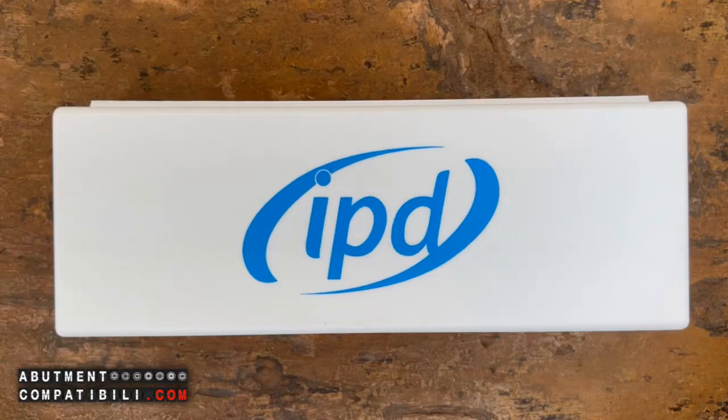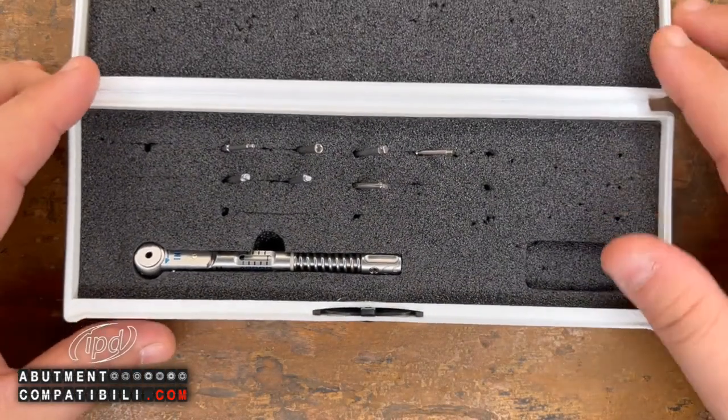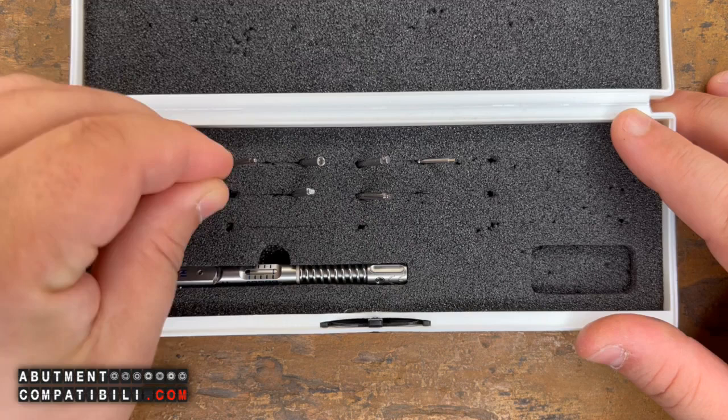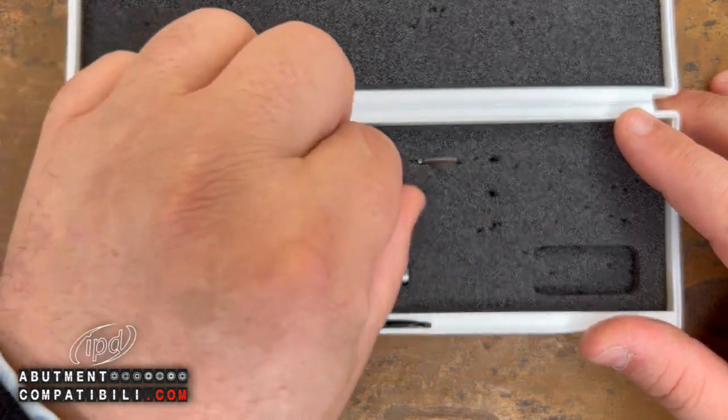The IPD kit can be purchased individually, meaning just the ratchet. As a kit, it is extremely advantageous, as it comes with the ratchet along with a whole series of tips and screwdrivers for working on different implant techniques. So we will have the hexagonal tips, the cutting tips, the torx tips, and the star tips.